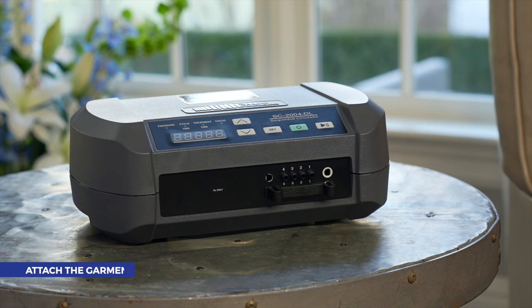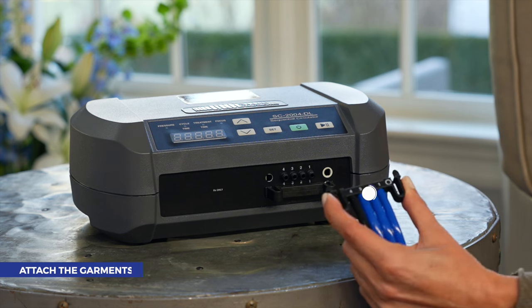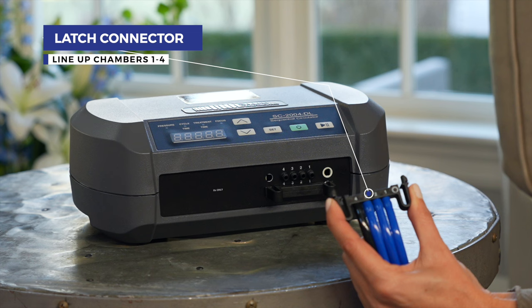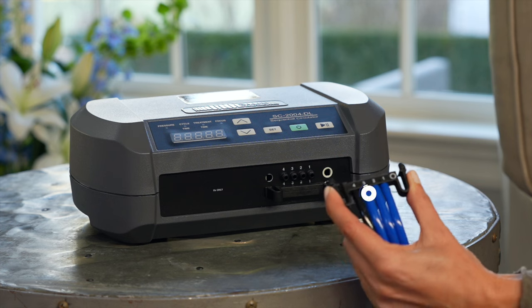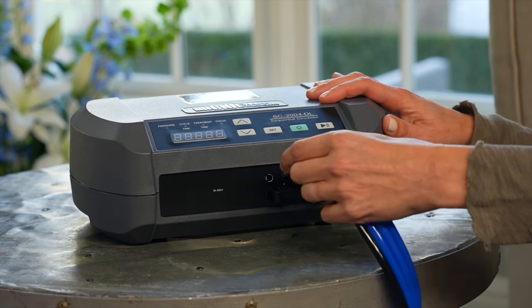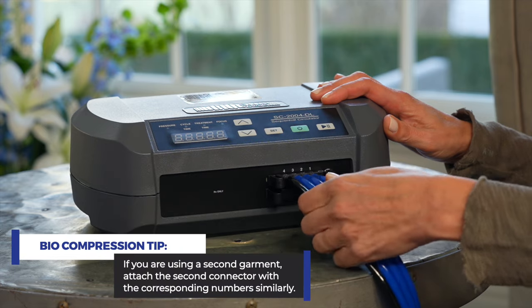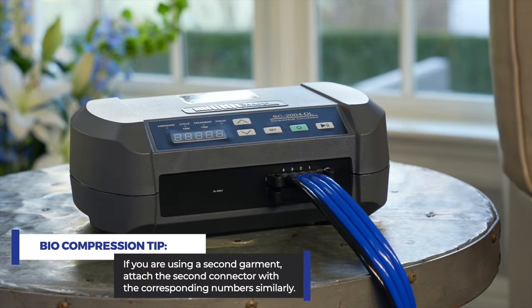Now it's time to attach the garments. The quick connect system makes it easy to connect tubes from your garments to the pump. Line up the chamber numbers one through four on the latch connector with the corresponding numbers on the pump. With the numbers facing up, squeeze the clip and insert into the port. If you are using a second garment, attach the second connector with the corresponding numbers similarly.